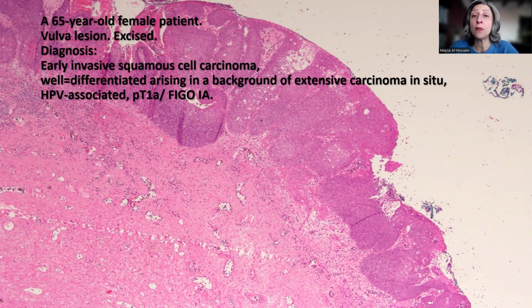Now, the stroma in the background might show edema and or features of desmoplasia, but really the clue to the diagnosis of early invasion comes from what is very well known in the literature as paradoxical maturation. Instead of seeing the same cells that are forming the carcinoma in situ invading, on the contrary, what we see invading are cells showing better cytoplasmic differentiation, larger in nucleus, more prominent in nucleolus.